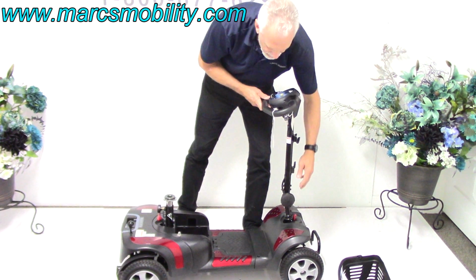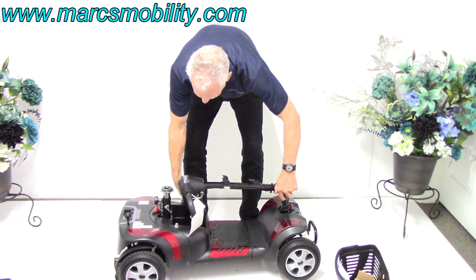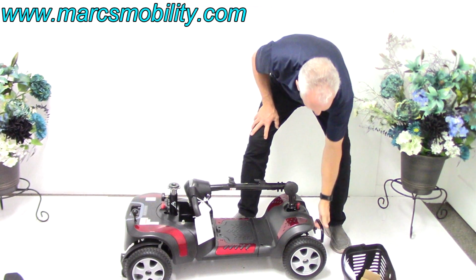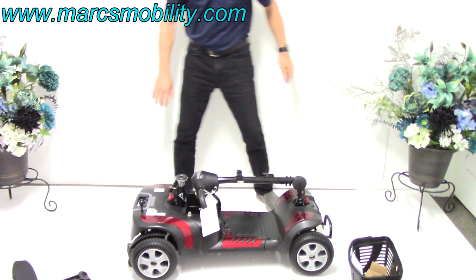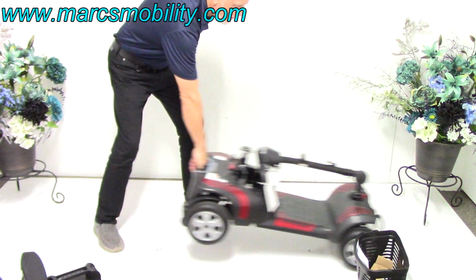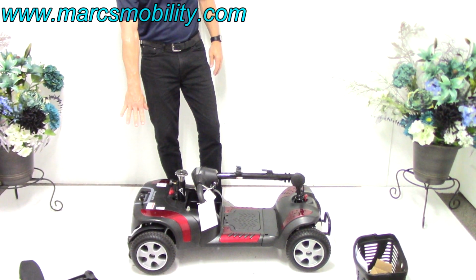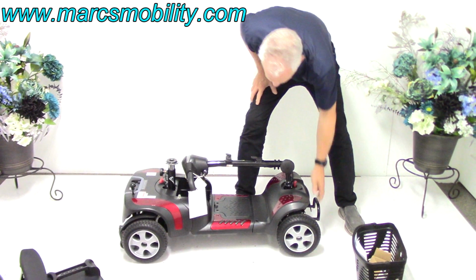You could, with two people, if you put it like this, you could have someone grab the front. It's a good handle right here in front. Look at that handle right there. Perfect. And someone could grab it here, and you could put it in the car in one piece. But the back end is going to have all the weight. There's not any weight here really to speak of.